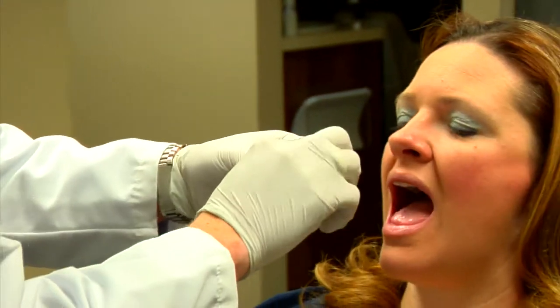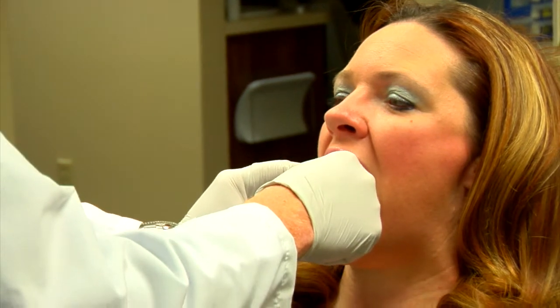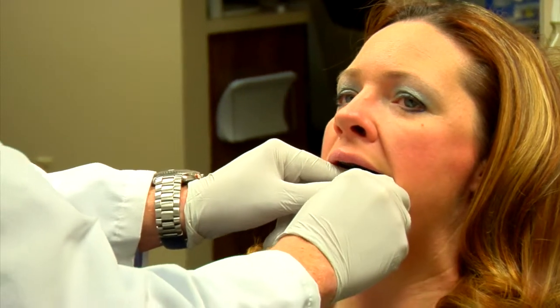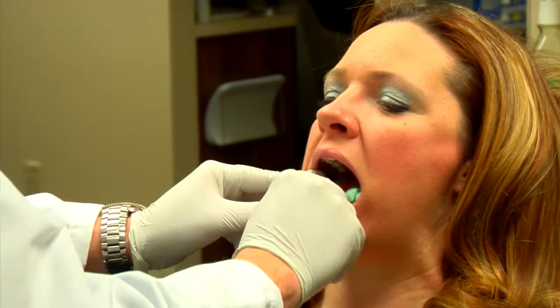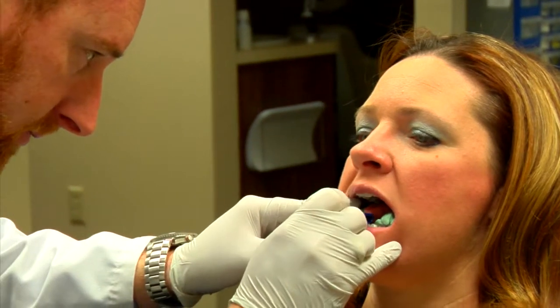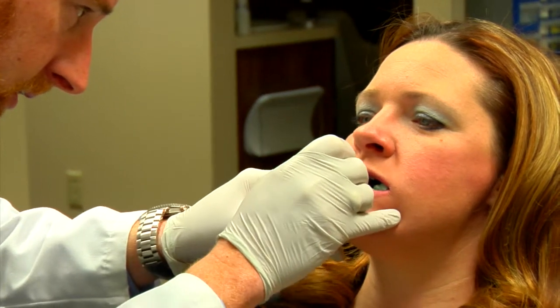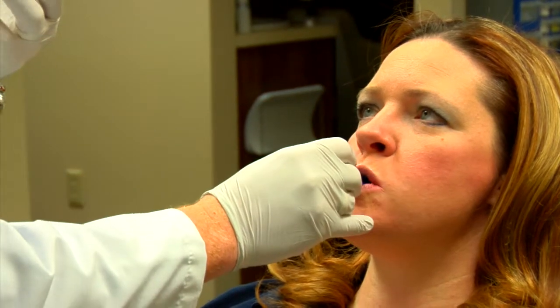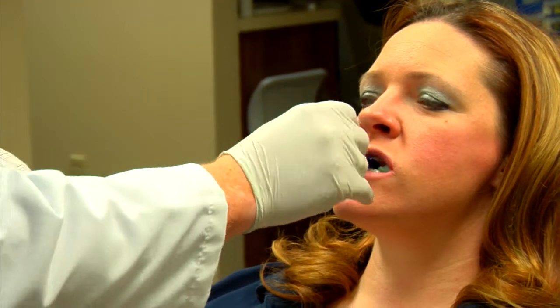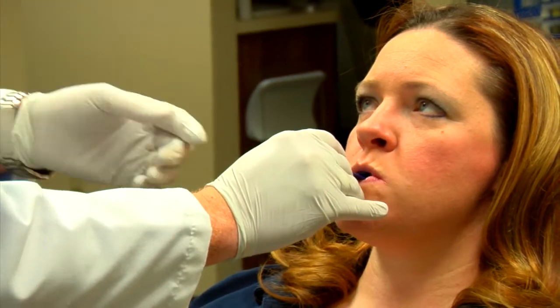Okay, go ahead and open for me. And just place this on the posterior teeth on the bottom. Okay. And slowly start closing for me, and bring your jaw forward till you feel that click. Good. And push your tongue forward and nice and broad. Forward a little bit. Click. There we go. So her jaw is into that forward position. Tongue is forward and fat.